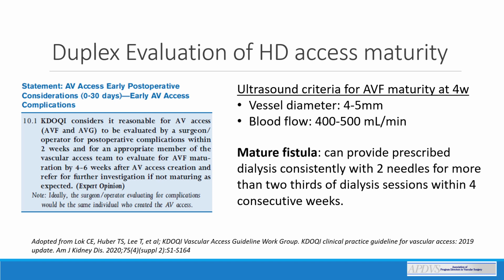Combining venous diameter and volume flow measurements increases our ability to predict fistula adequacy. A venous diameter of 4 millimeters or greater and flow volume equivalent to or exceeding 500 mL per minute confirms AV fistula maturation in 95% of cases, versus a maturation rate of only 33% when neither criterion is met.